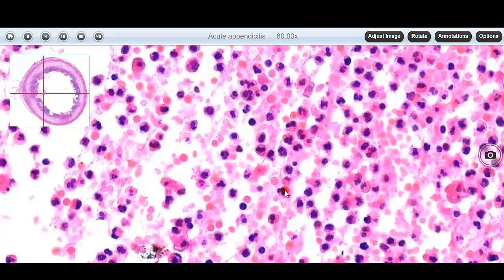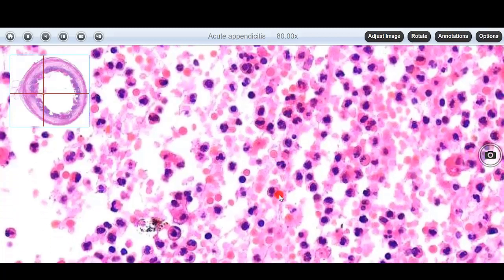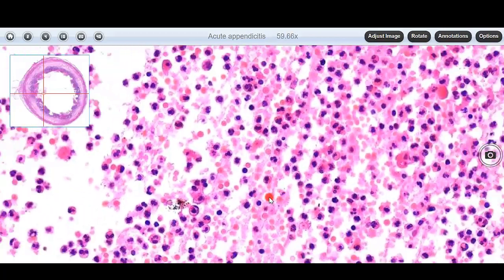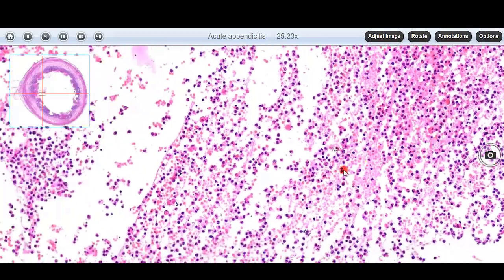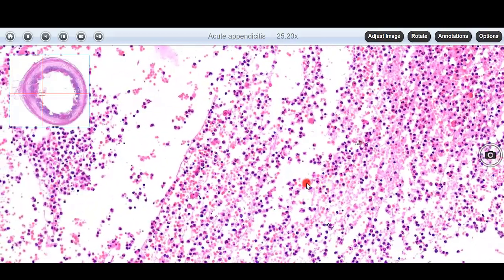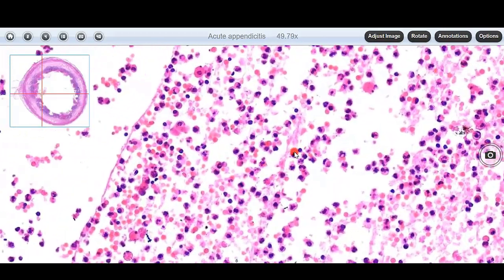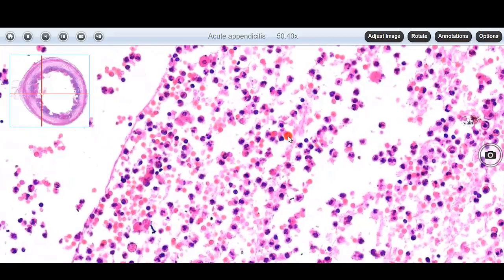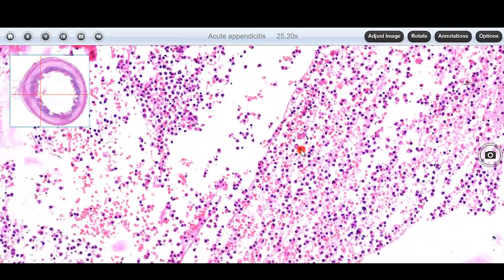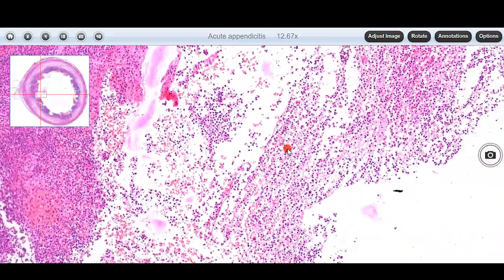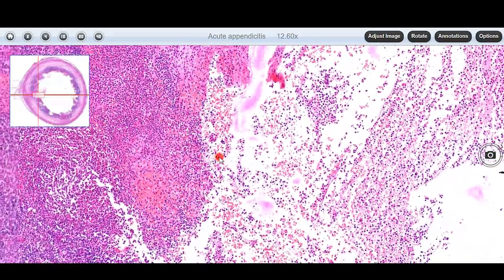How do you identify a neutrophil? It is a segmented WBC and has commonly three lobes. Along with the neutrophils, we can see many RBCs and some fibrin.